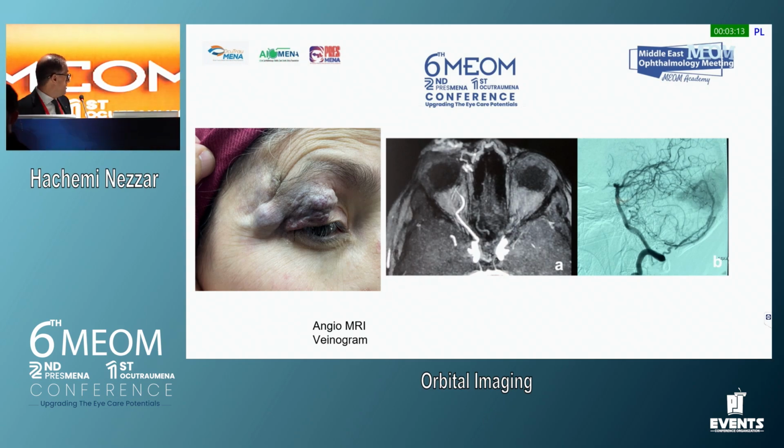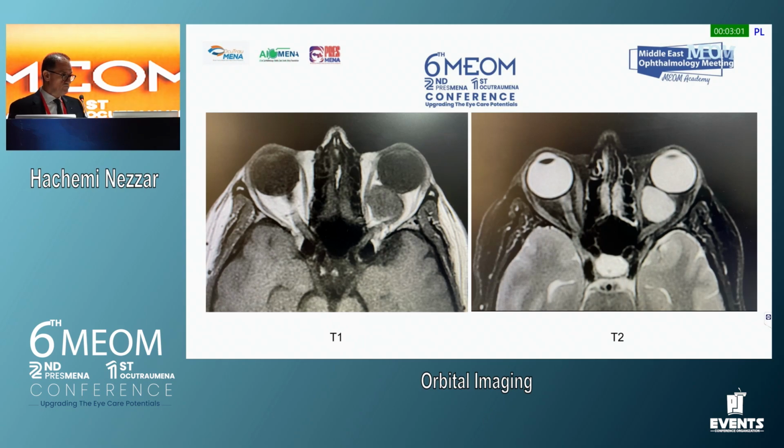And for example, with this patient, you have to think twice before offering any sclerosing treatment. You know that there is expansion inside the orbit and there is a risk for your optic nerve. So this is a very, very helpful exam in this situation.